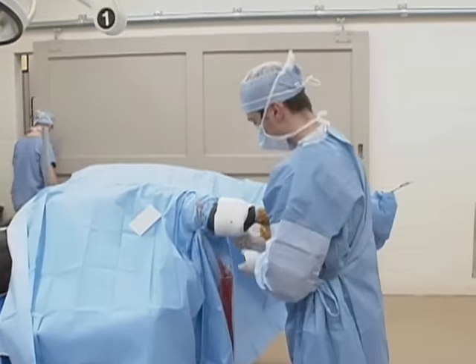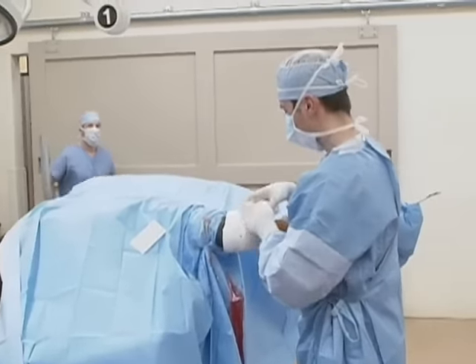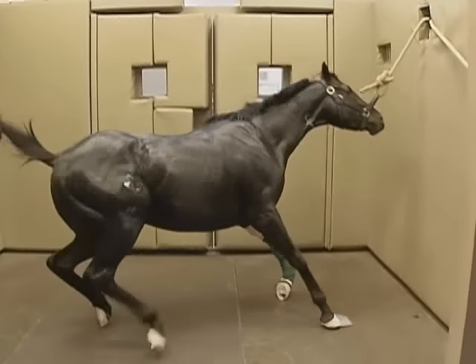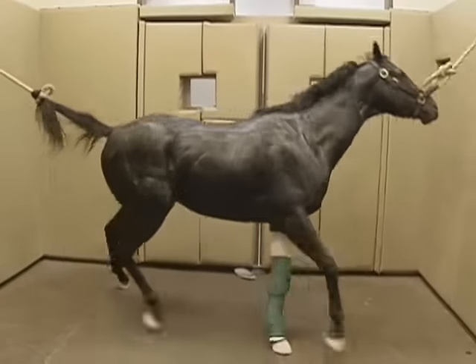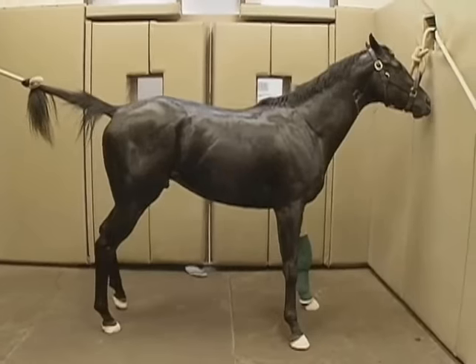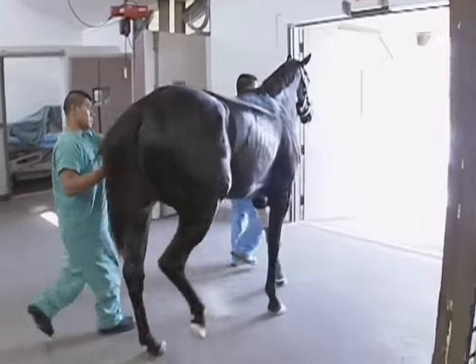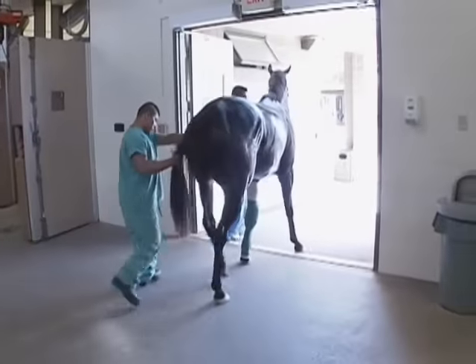The surgery is completed and the area is sutured and bandaged. The horse is then placed in the recovery stall. Ropes are placed on the tail and on the head and used to steady the horse when he stands and to prevent him from banging into the walls or injuring the recovery personnel. Most horses recover from general anesthesia within an hour of being placed in the recovery stall.